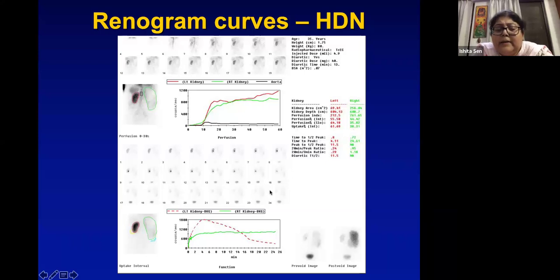And you can see that on uptake, this kidney is showing a percentage uptake of about 38%. Now, 38% is too much, isn't it? I mean, when you look at it visibly, this kidney does not look like a salvageable kidney. So why is it showing 38%?